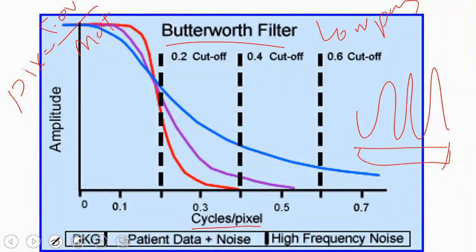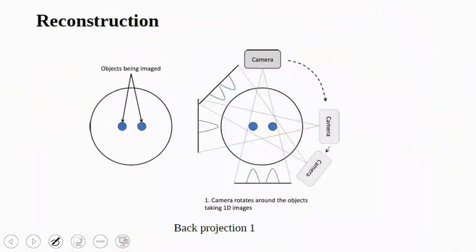If you have 100 squares and you set your field of view to 10 centimeters, and then you increase your field of view to 100 centimeters, then the square must increase in size so that the 100 pixel squares inside the image cover those 100 centimeters in the field of view. This means that the pixel size will increase. So when the pixel size decreases, why does the resolution increase? Because as we discussed earlier, if I have an object that is small and my pixel size is large this way, and there are 2 objects that are close together, they will give you the same signal.